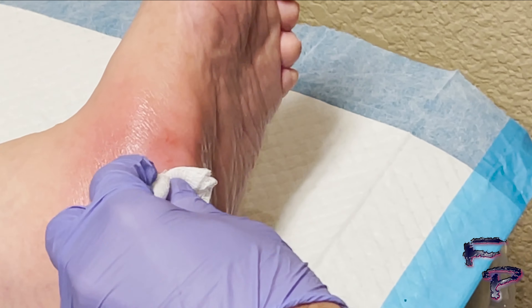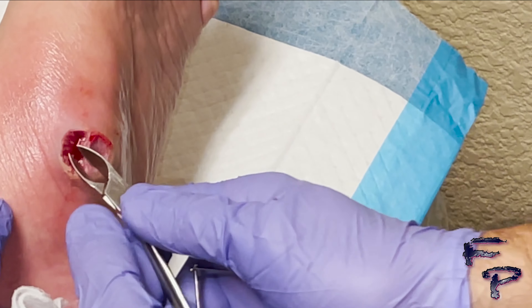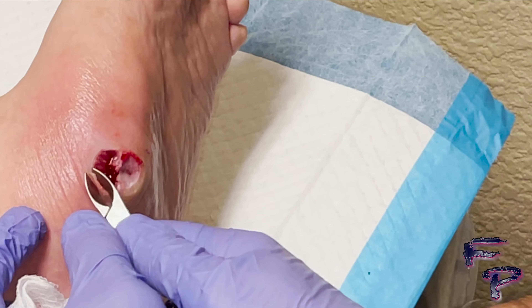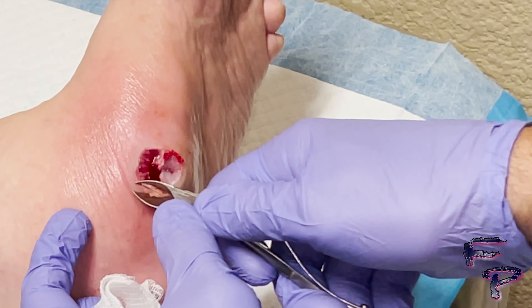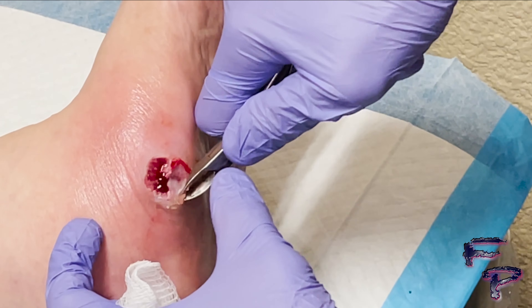In between, I am using a damp 4x4 to clean up the area and continue to make my way around the edge of the open wound to remove all non-viable tissue.